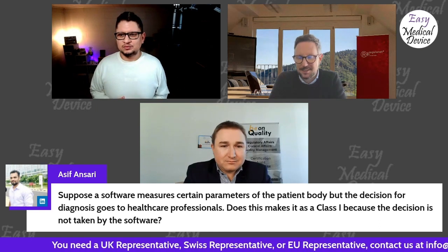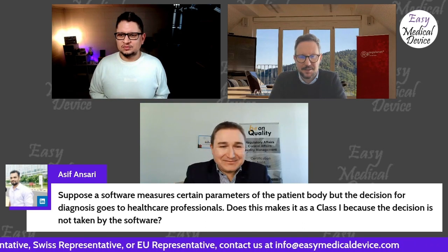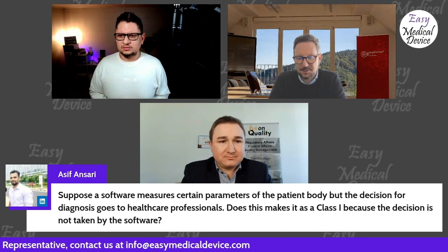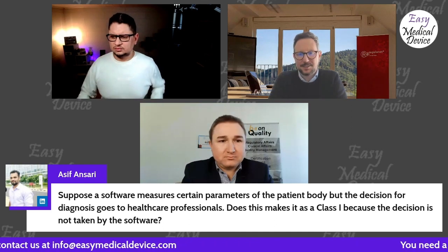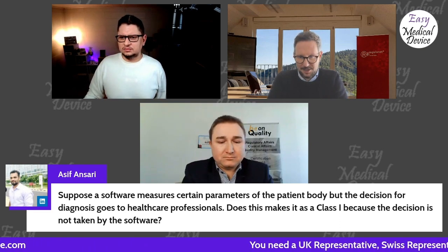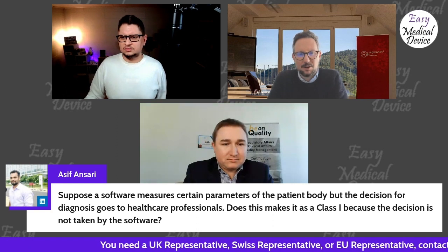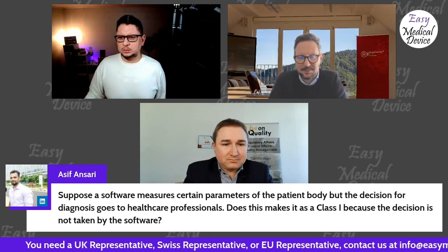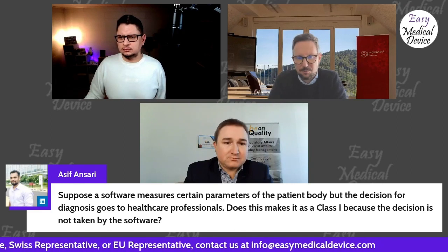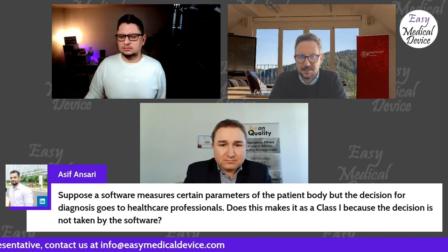This is one of the typical topics when you need to qualify a medical device software. Of course, if a software like this provides sufficient information that you can take a decision, even if the physician will make this decision alone, it doesn't mean that the software is not a medical device, because this would usually be called clinical decision support software, and this falls under the definition of a medical device.